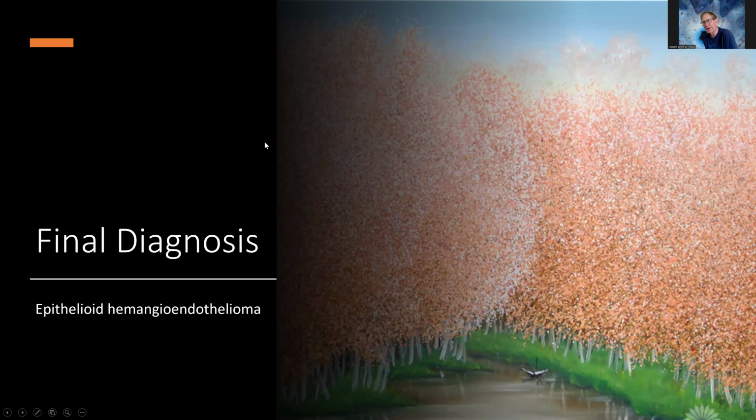So our final sign-out diagnosis for this case is epithelioid hemangioendothelioma with a YAP1-TFE3 fusion, most likely the source of the neoplastic proliferation.